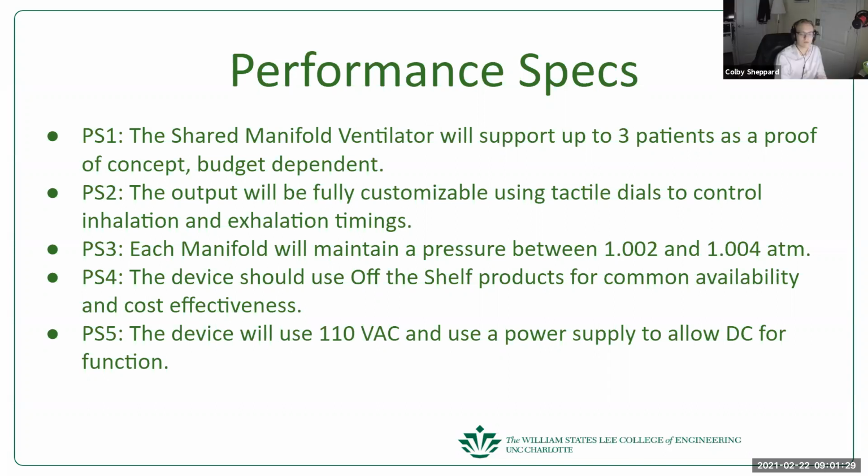Okay, for the oxygen though, how are you able to adjust that? Is that just a manual valve, or would that be the airflow? There's a pressure transducer that'll read the pressure from the oxygen tank, and we're able to change the pressure in the manifold based on how much it needs. We can open and close the valve as needed, based on the readout from the pressure transducer.